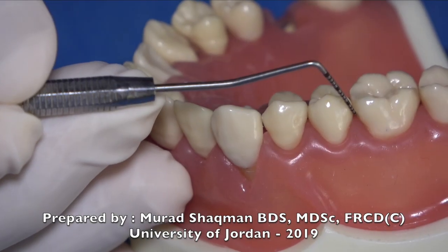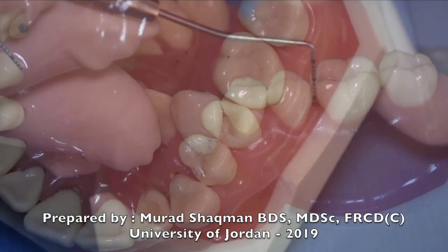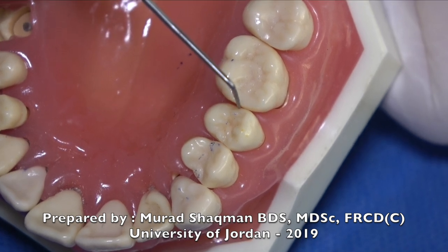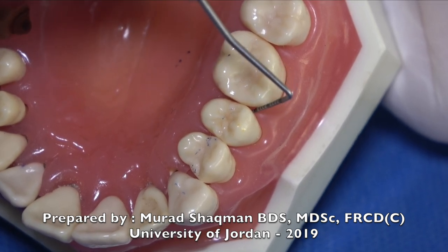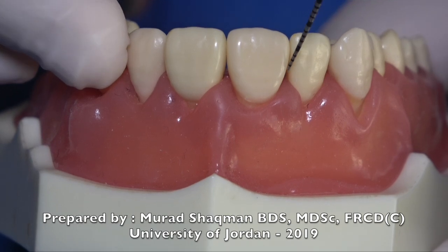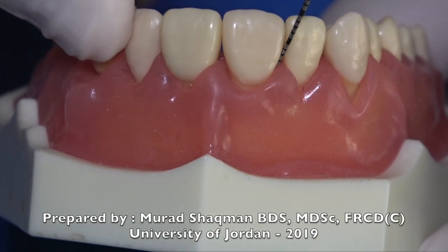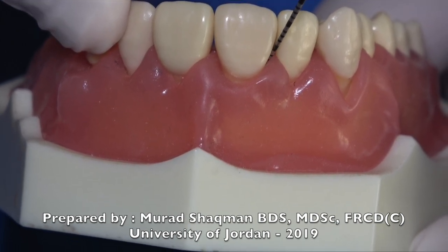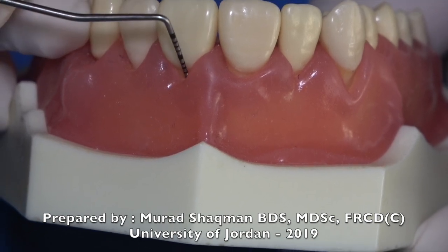Going to the distal of the second premolar, tilt the probe and slide. Imagine you want to introduce your probe right over the contact area but you can't, so you slide and then tilt the probe inward to go and probe under the contact. Start on the distal of the incisor, take it further interproximal, tilting the tip of the probe towards the interproximal area under the contact. Pay attention to how the angulation changes with each position.